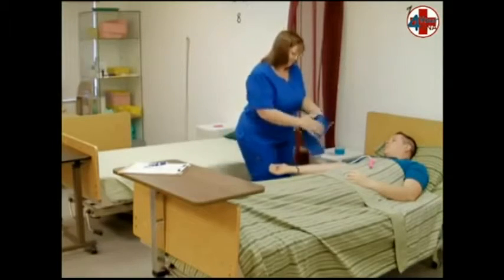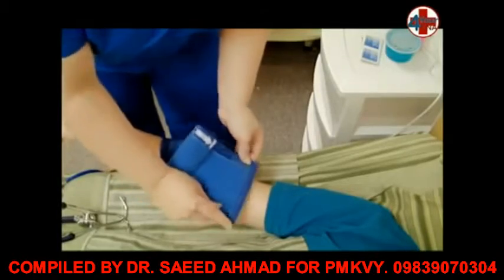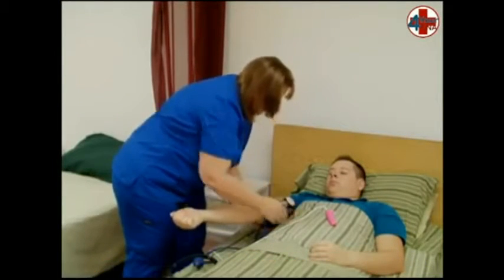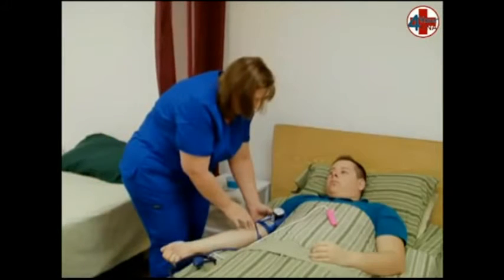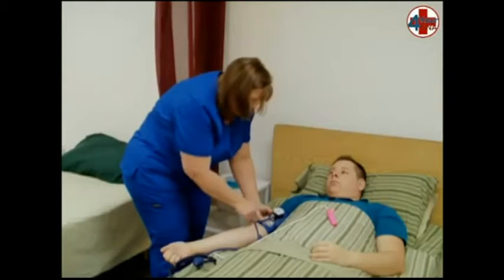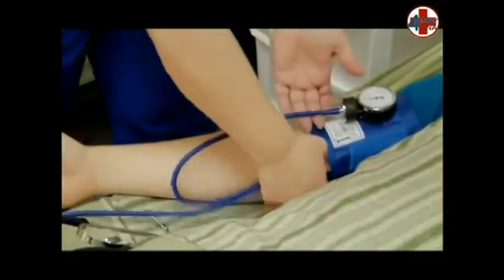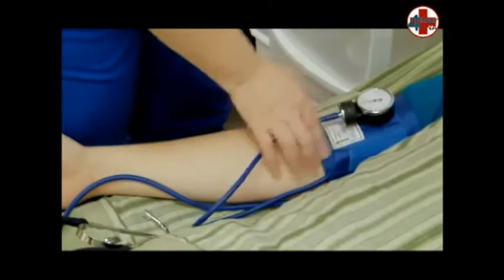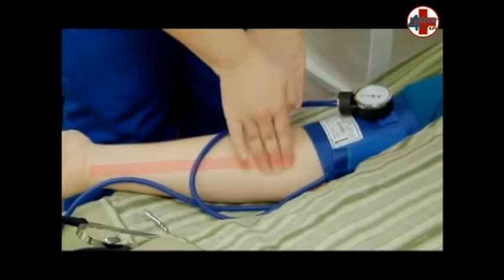Measure the cuff by laying the narrow end of the blood pressure cuff over the arm and making sure it covers one-third to one-half of the circumference of the arm. Wrap the deflated cuff around the upper arm at least one inch above the fold of the elbow; the cuff will be secured with Velcro as you wrap it. The gauge should be facing you. Make sure the tubing is not kinked or under the cuff and identify the arrow that will point to the brachial artery on the lower edge of the cuff. The brachial artery is best felt at the fold of the elbow on the pinky side.